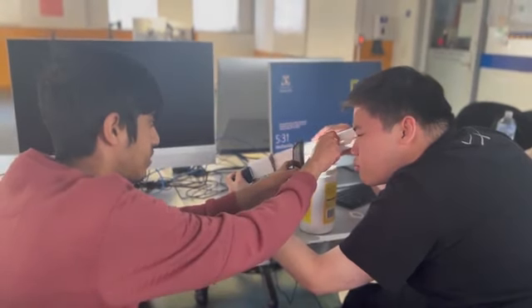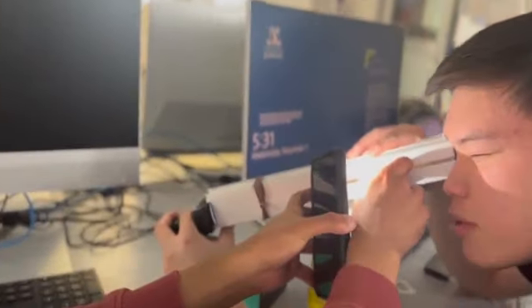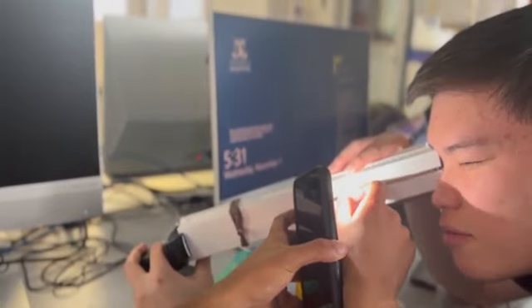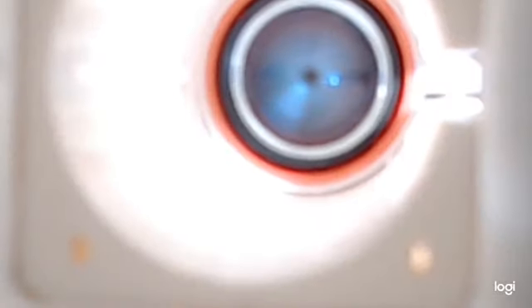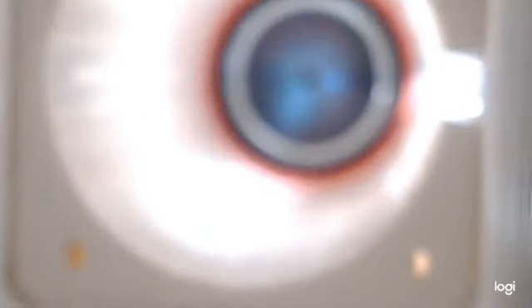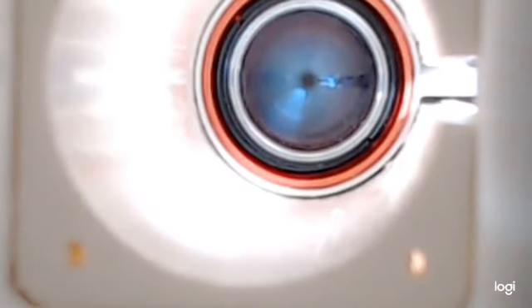In practice, the camera is connected to a computer. The condensing lens is within the 3D printed case, and an external handle allows adjustments. Here is some video we obtained. Unfortunately, we don't get a very clear image of the eye. This could be due to insufficient lighting or the pupils being too constricted.